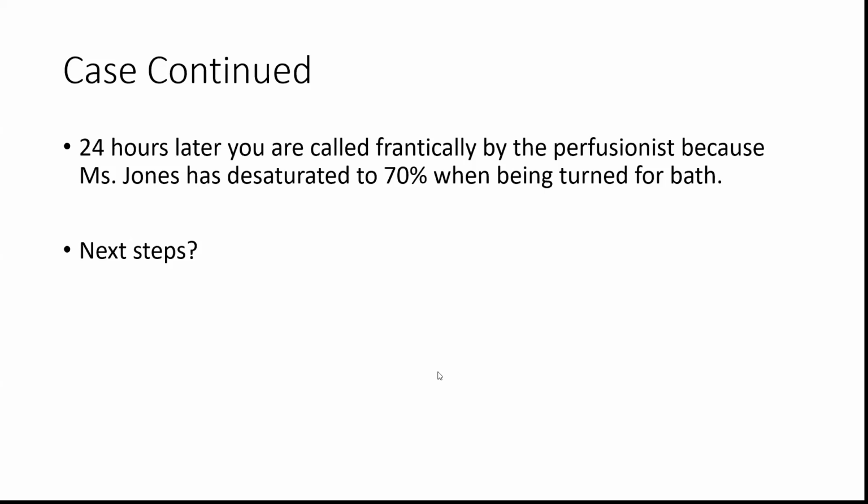If there's a kink, if there's any misplacement, there are usually indicators on the outside. Exactly. Yep. So if it's being changed, if the suture has fallen, or if there's any change in the color of the blood, if it's chugging, and what are the prior settings, 4 liters and 5 liters. Is the circulation still the same or not? Good. I appreciate that. Going to the bedside first, doing a circuit check is absolutely important. Everything that you mentioned. What else?